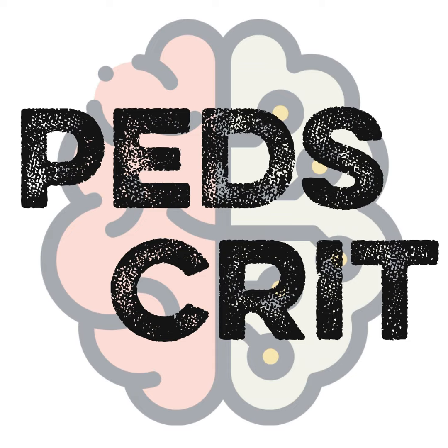You can certainly institute plateau pressure as something that should be monitored, but it's not currently within our workflow. So until we have a culture change where that thing that you want us to really monitor is being monitored, then you need to come up with some sort of surrogate. So about a year ago, one of our now fellows at CHOP and I published a paper in which we explicitly asked this. We had a bunch of patients on their baseline vent settings, and then we flipped them into volume control and measured their plateau pressures just to see how off PIP was. And PIP is not that far off. It's usually within 2 in most measurements, and well over 95% of measurements that we took.